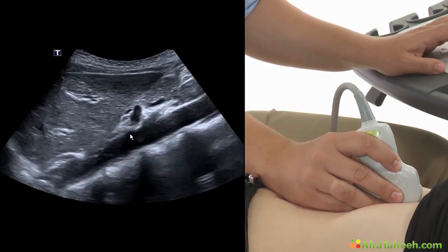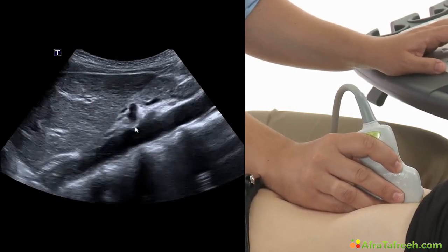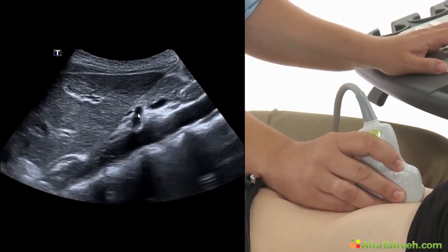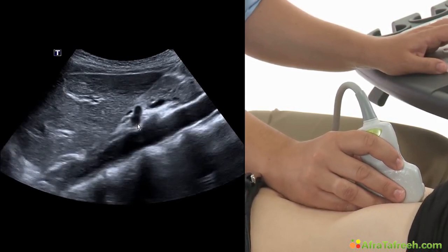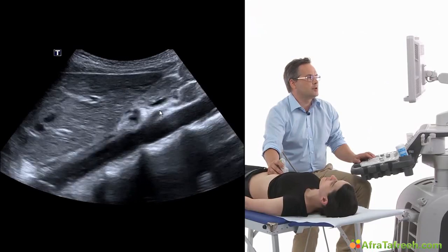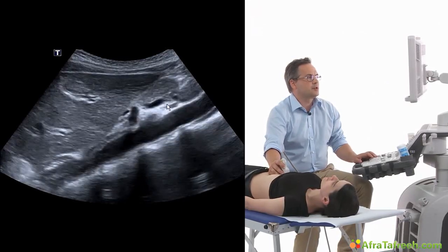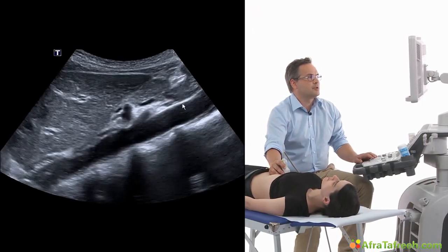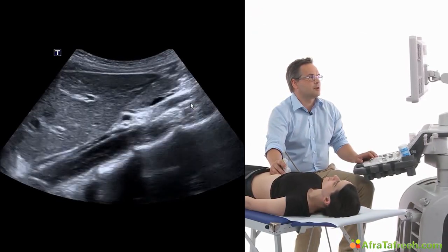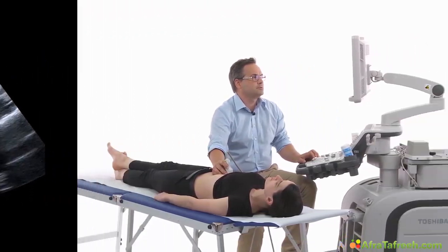And when we display the aorta, we can easily detect the first branch of the aorta, the celiac trunk, over here, and only 1 centimeter below, caudally, the origin of the superior mesenteric artery, which follows the aorta in a parallel course from cranial to caudal.